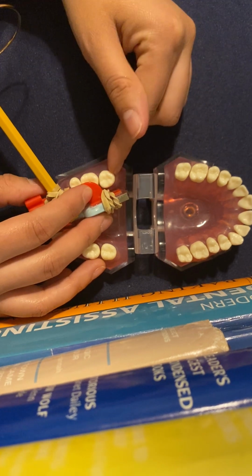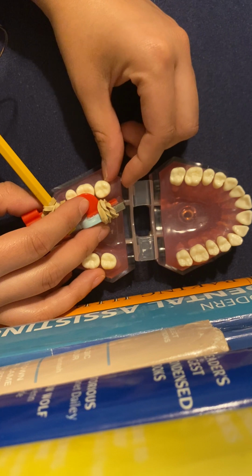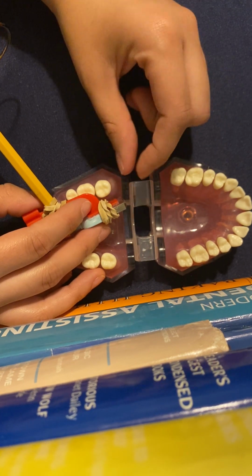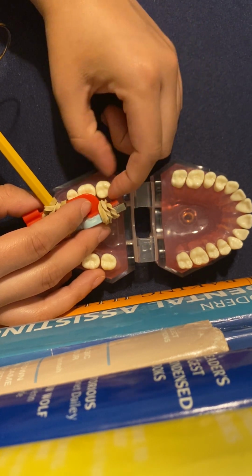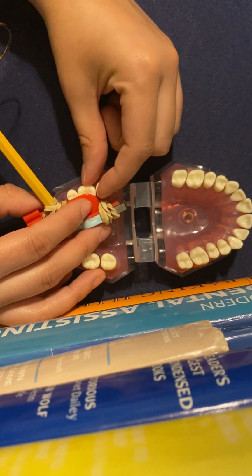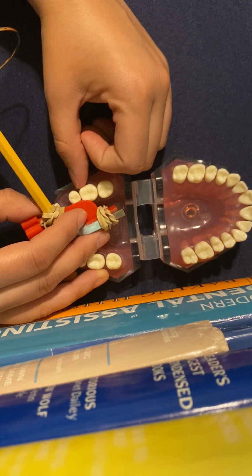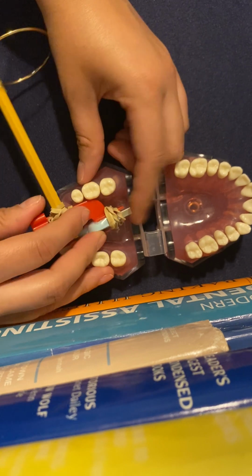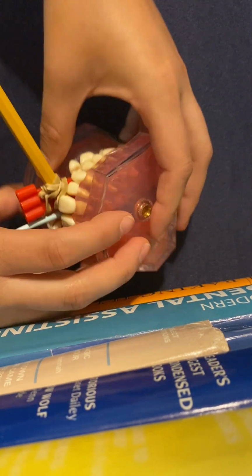And the trick with this is, I won't say it doesn't matter, but we can see the third molar. For this one we want to make sure that we get a little bit of this area. If there was a third molar back here, we wouldn't necessarily need to get the edge of it, because we can see that with our bare eye. But we definitely want to get these teeth right here and this part right here, because we can't see in between the teeth. So we're going to line it up like so. Bite down.